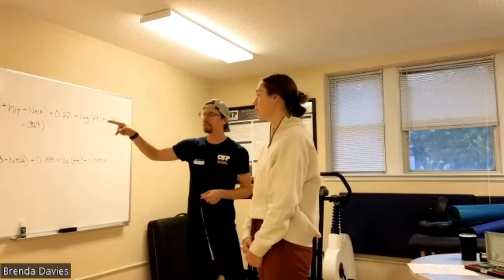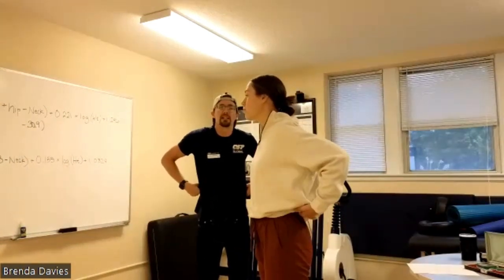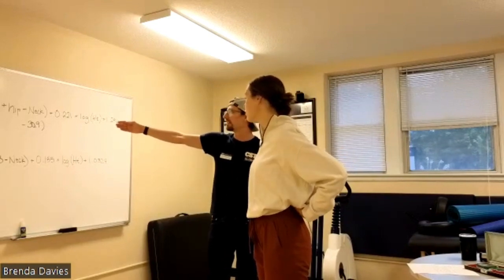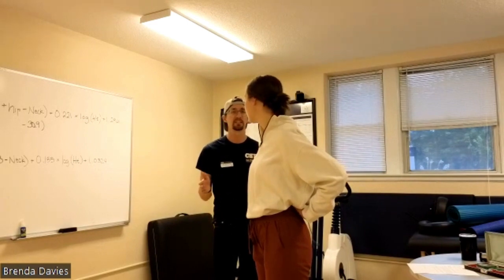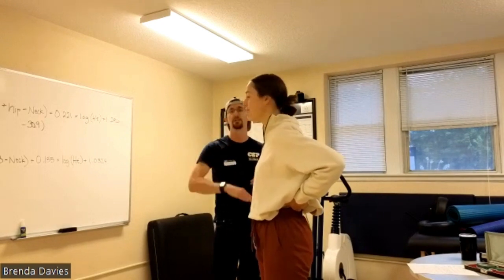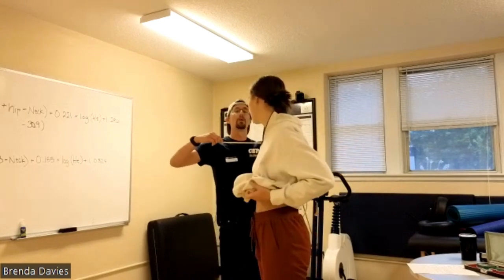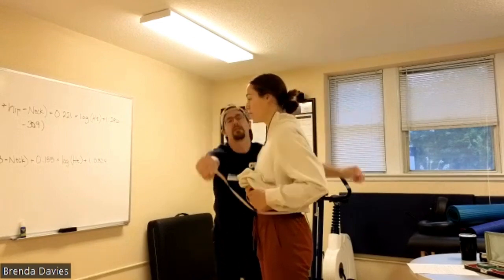So the next one is going to be the upper ab or the waist. That's the narrowest part of the body. And one thing I do want to highlight, I'm standing to the side of the client. As we get down to like the hip, if I'm not on the side, my hand placement gets really awkward. So making sure that you're standing off to the side when you're measuring each of these, just for professionalism and making the person feel confident and comfortable. So when we start getting into the torso of the individual, I typically do kind of like that.